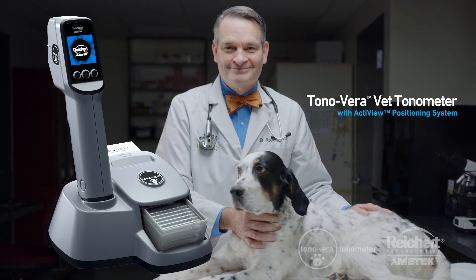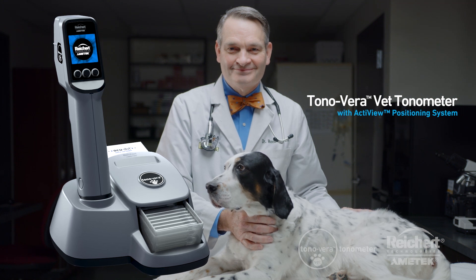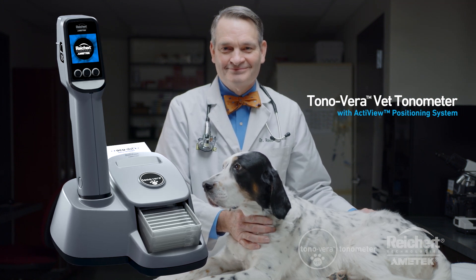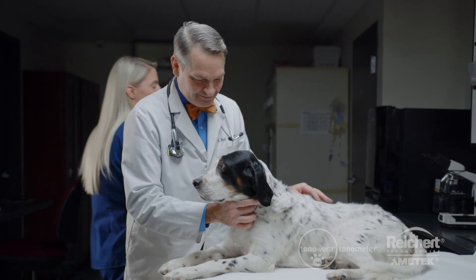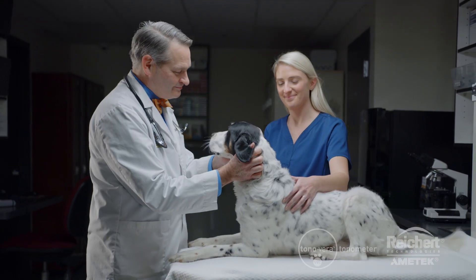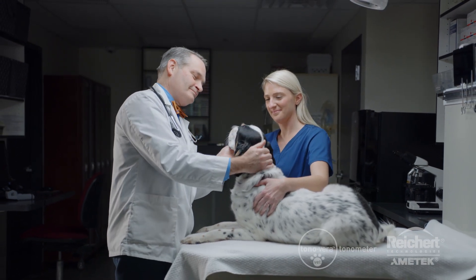The Tanavera Vet Tonometer features the advanced ActiveView positioning system, which quickly guides you to the center of the cornea, giving you confidence in your intraocular pressure readings. It utilizes rebound tonometry technology to obtain intraocular pressure without the need for topical anesthesia.